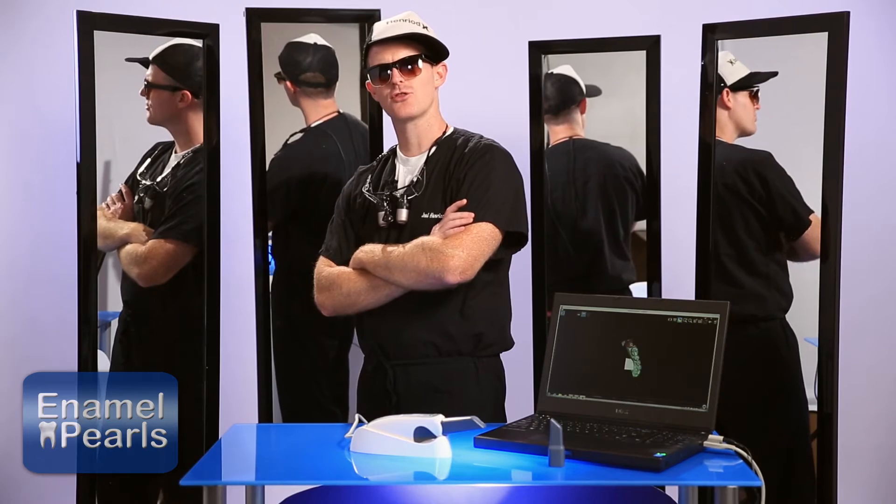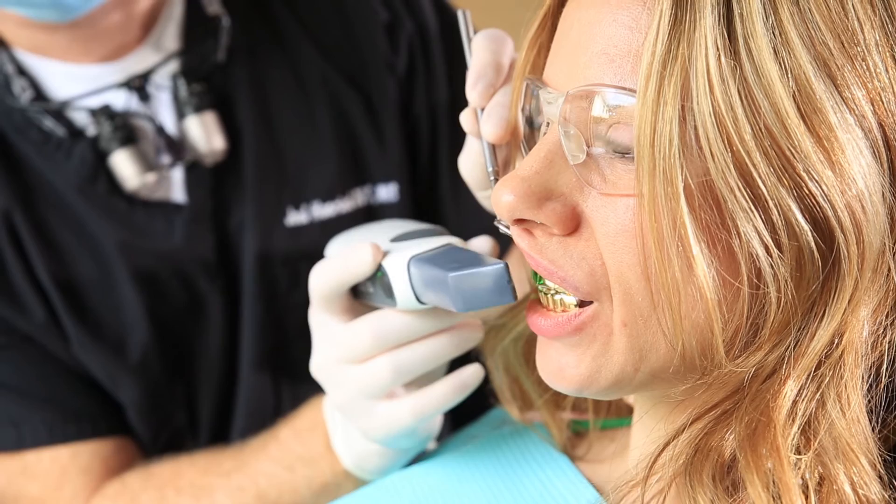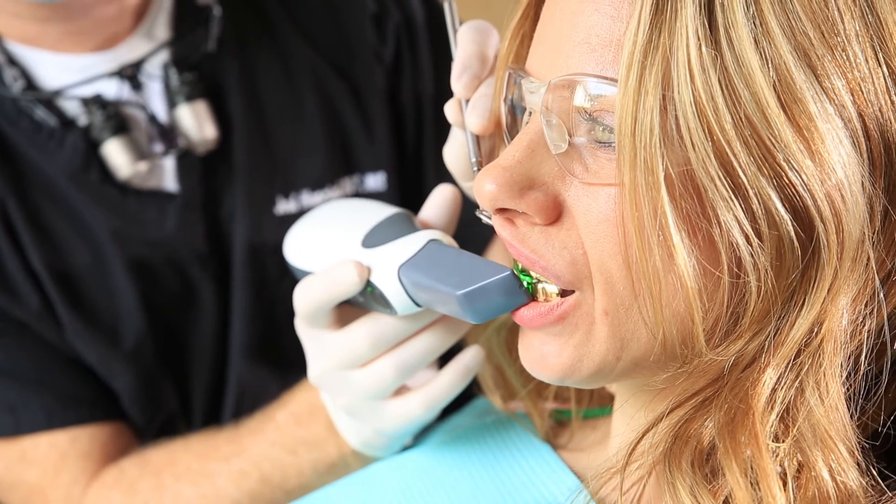Luckily, there are a few things you can do to better scan shiny surfaces. I'm going to share three tips. Number one: the best tip for scanning reflective surfaces is to angle the Trios 3500 so that light does not go straight back into the tip.